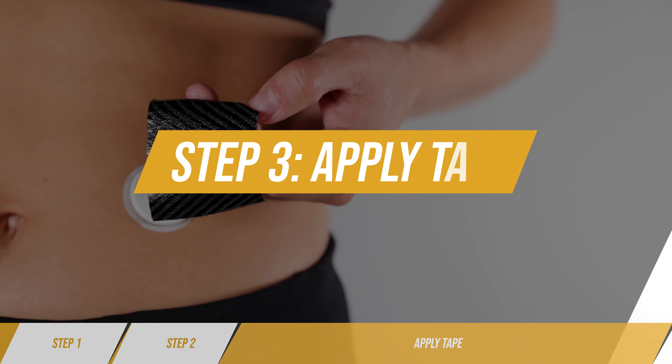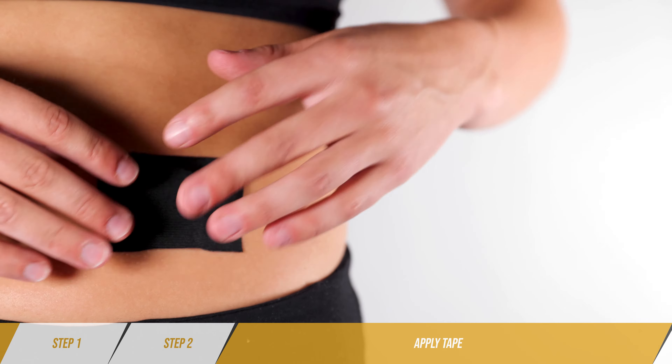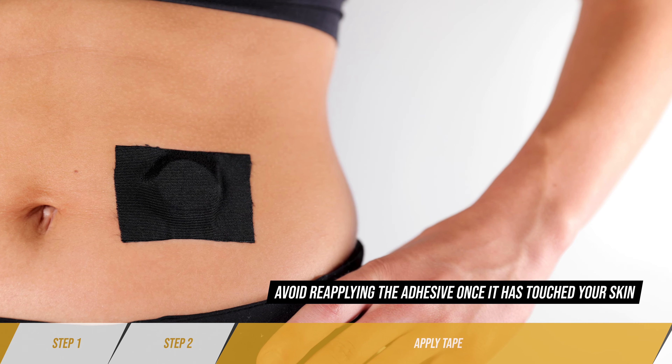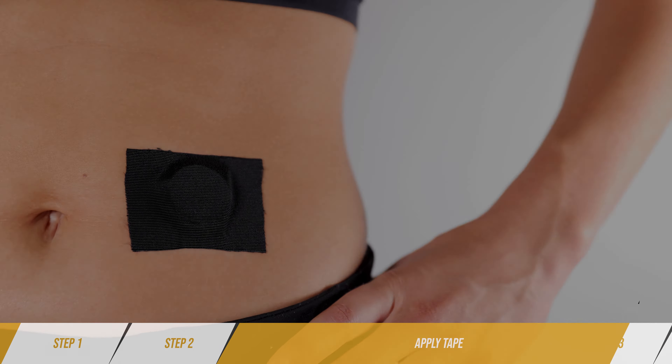Step three: apply tape. Apply your piece of tape over the device. Firmly press tape to skin and remove any wrinkles. Wait one hour before activity.